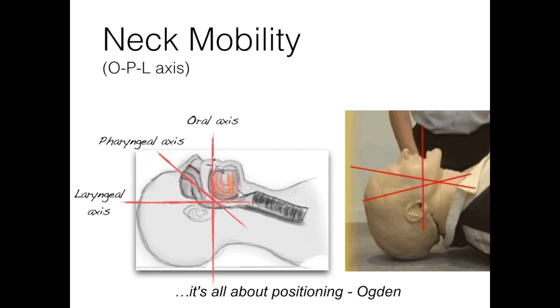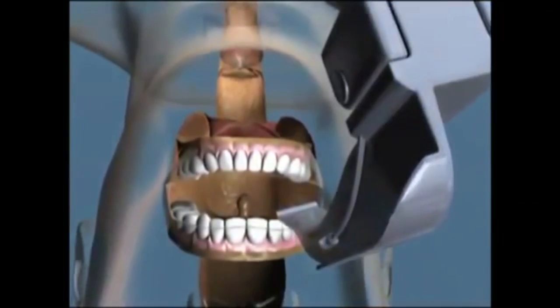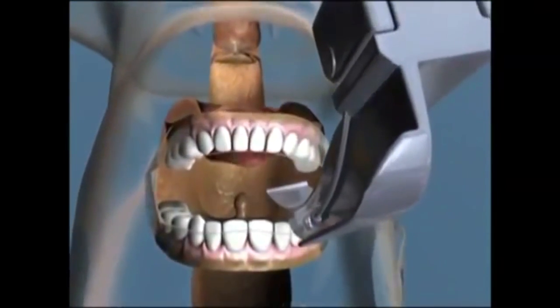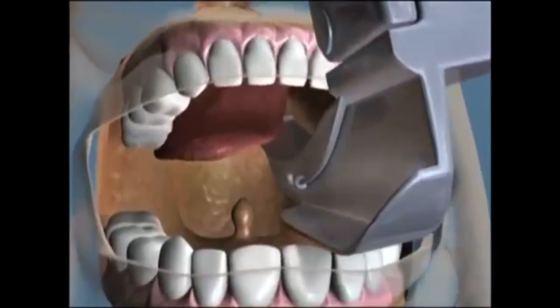Successful intubation is dependent on aligning the oral and pharyngeal curve with the laryngeal curve. Axis alignment is done by extending the patient's neck. With the clinician standing at the head of the bed and the patient lying in the supine position, the laryngoscope is inserted into the mouth from the right side, moving and trapping the tongue over to the left, out of the line of sight. This maneuver makes a view of the glottis possible.